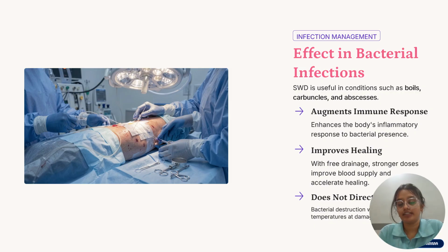Now, effect on bacterial infection. SWD is useful in conditions like boils, carbuncles, and abscesses. It augments the immune response and enhances the body's inflammatory response to bacterial presence. It improves healing: with free drainage, stronger doses improve blood supply and accelerate healing. It does not directly kill the bacteria. Bacterial destruction can be done with high temperature.